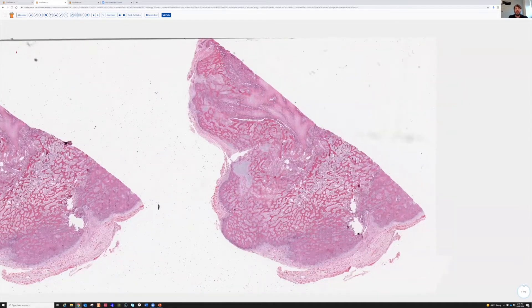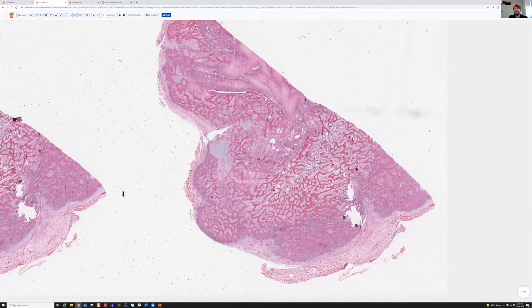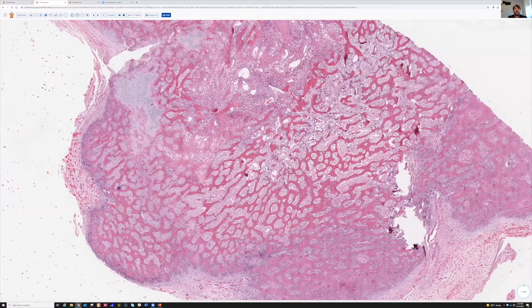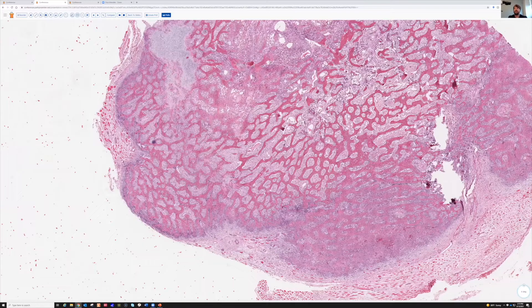Even at low power, you recognize there's bone everywhere. But on imaging, this was actually in the soft tissue and not in the bone or attached to the bone. That's a really important question to ask: anytime you think you have something with bone or cartilage in it, you want to know - is it actually touching the bone, or is it totally in the soft tissue?